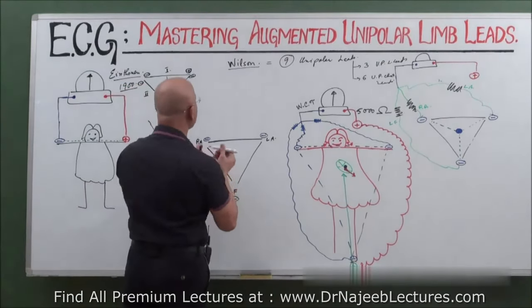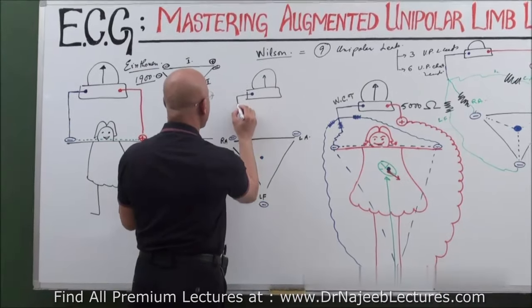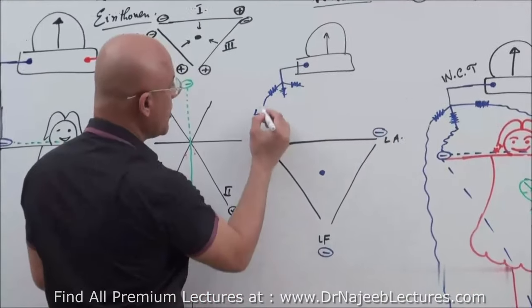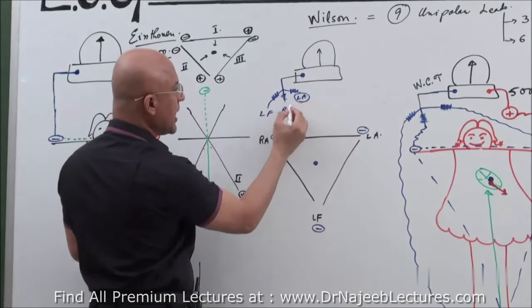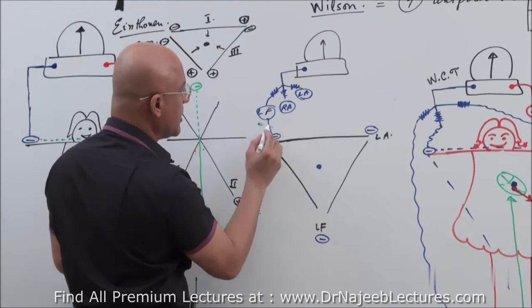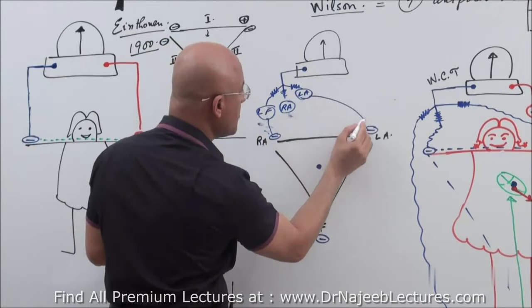After achieving this, suppose this is connected to the left foot, this is connected to the right arm, and this is connected to the left arm. When these three are connected like that, I don't want to make the real connection, or do you want me to make connections? Okay, I will make a connection. One, and this is the right arm. Sorry, left arm. What is this?